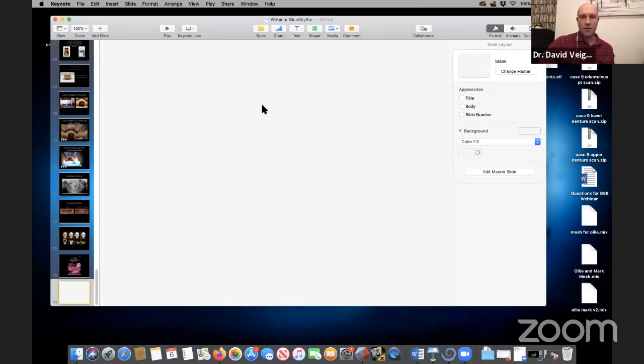So what is the tolerance you prefer? The next question is, what is the tolerance you prefer? I'm guessing you're asking about the tolerance between the sleeves. Generally the sleeve tolerance is 0.1 of a millimeter. So if I had, for instance, a guide tube diameter of 5, then the drill that would go into that would be 4.90. So there's a 0.1 sleeve tolerance between the two.